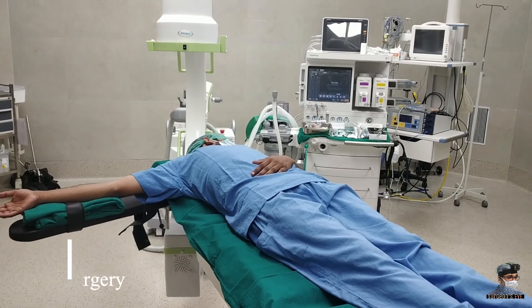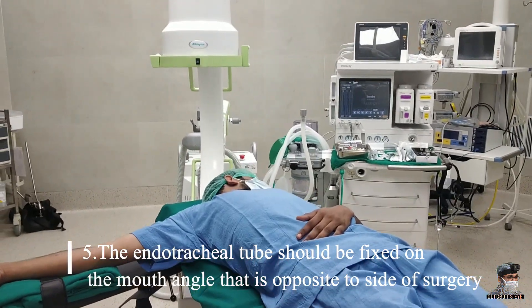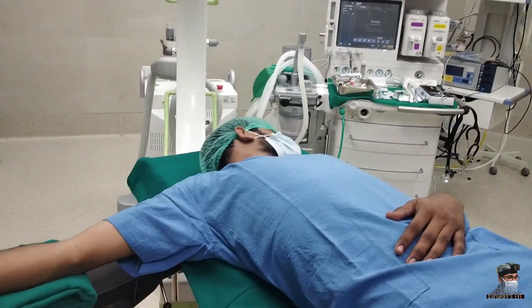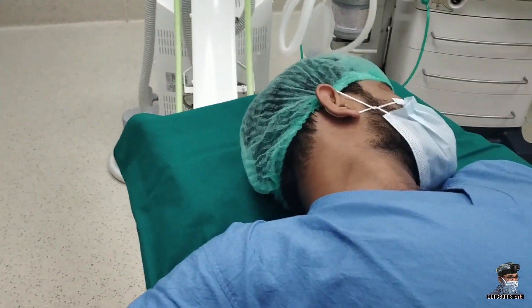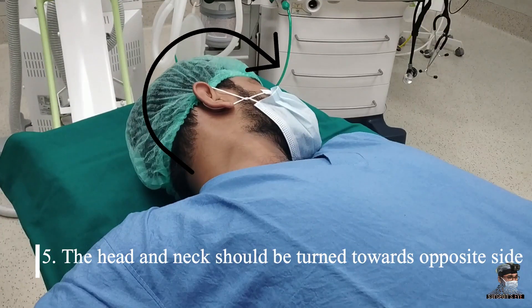The first instruction is to fix the endotracheal tube on the mouth angle that is opposite to the side of surgery. For example, if I am doing surgery on the right shoulder, the endotracheal tube should be fixed on the left side of the mouth. The second thing is to turn the head and neck of the patient towards the opposite side.